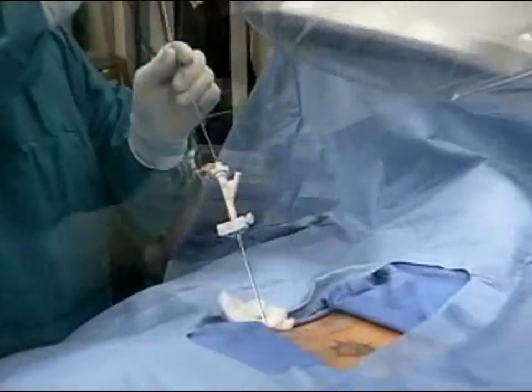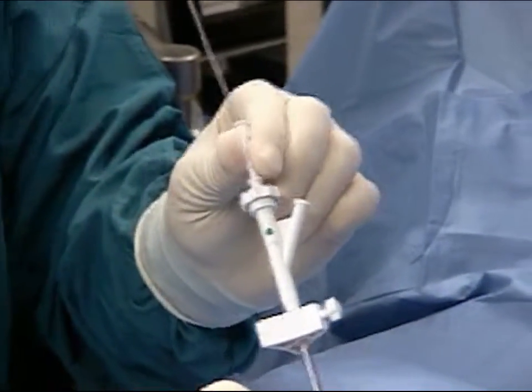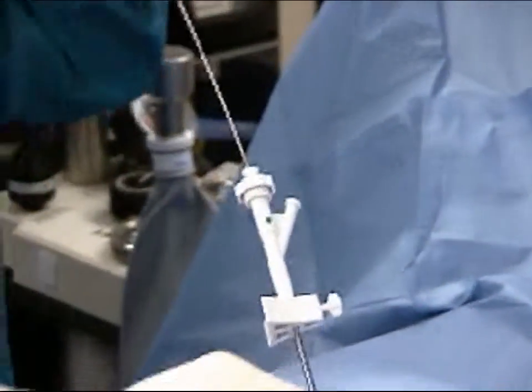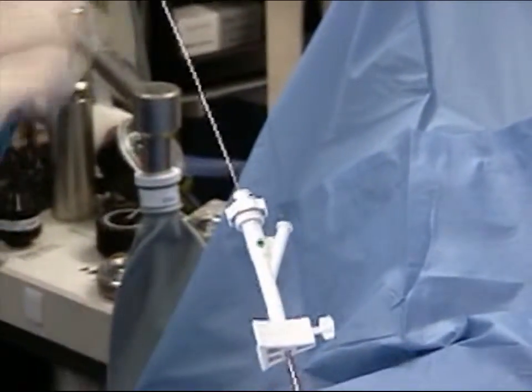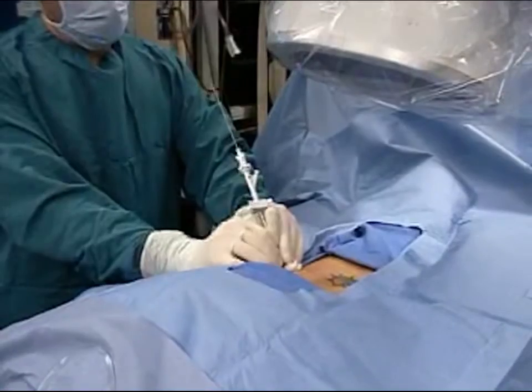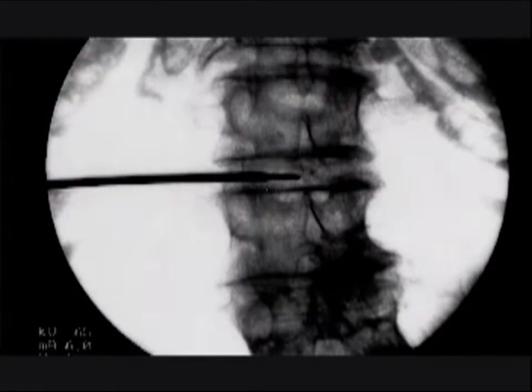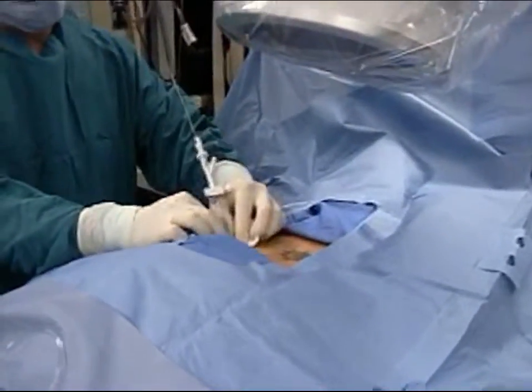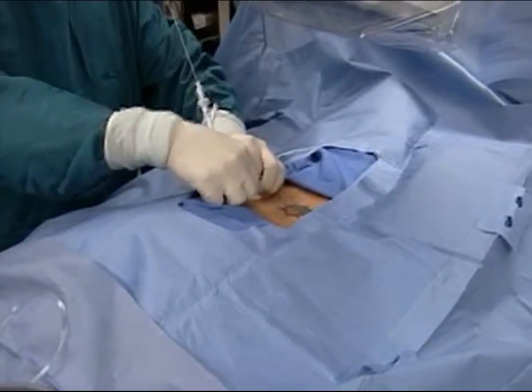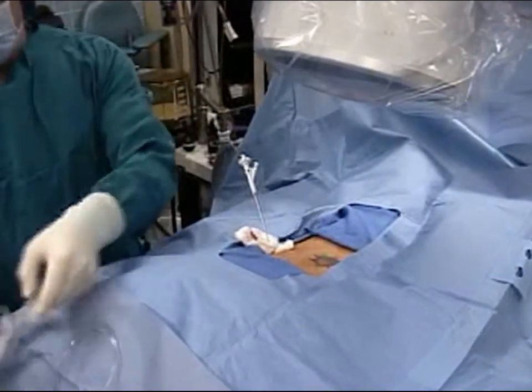Remove the dilator from the working channel. Insert the trephine. Score the annulus with the trephine, then remove the trephine. Re-insert the dilator and lock it onto the working channel's hub. Advance both the working channel and the dilator into the nucleus. Place a 4x4 between the skin and the skin stop and tighten the skin stop. Remove the dilator, attach the aspiration tubing, and you're ready to insert the LASE endoscope.